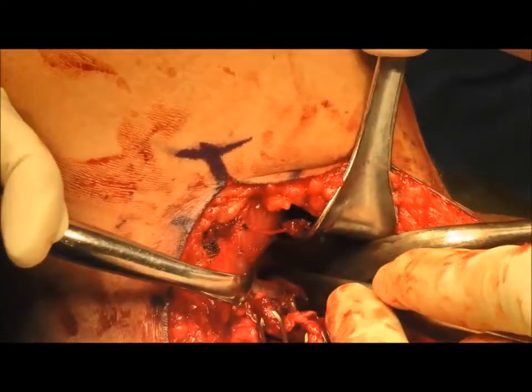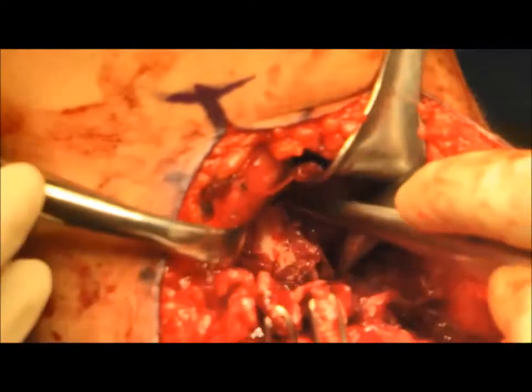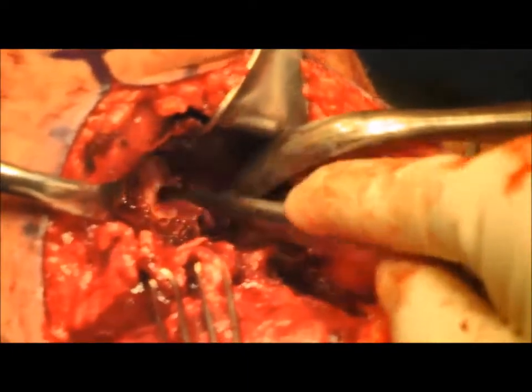Next, the cortical bone is abraded with a curette in order to stimulate a biologic healing response.